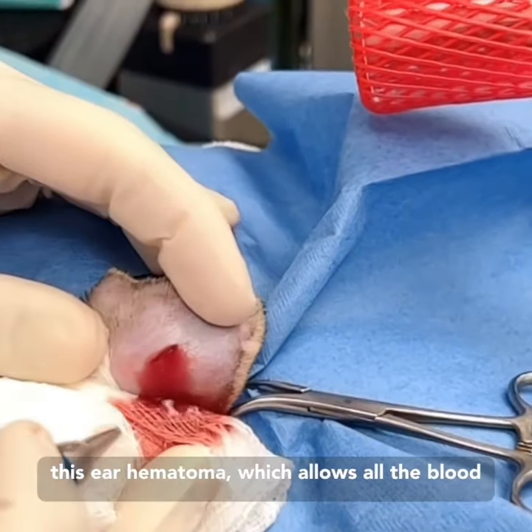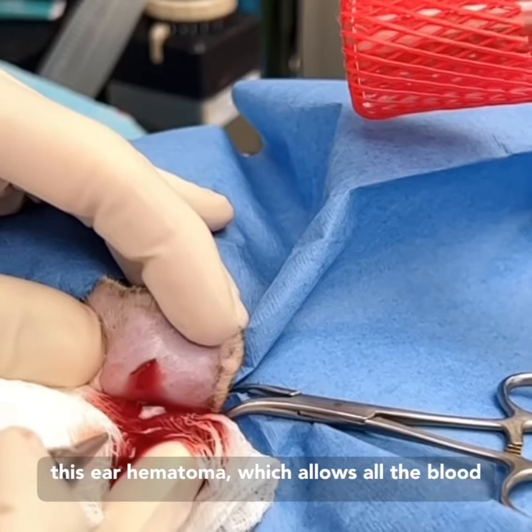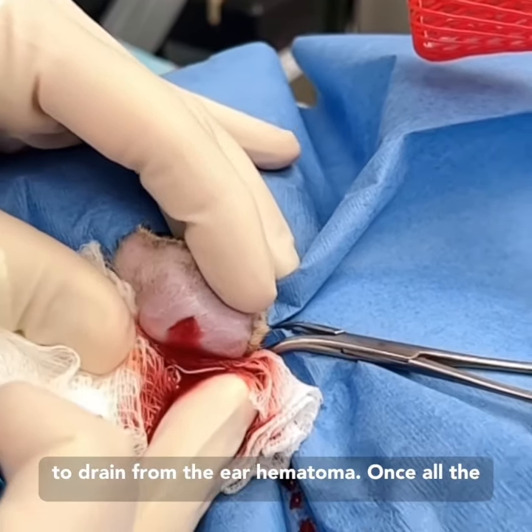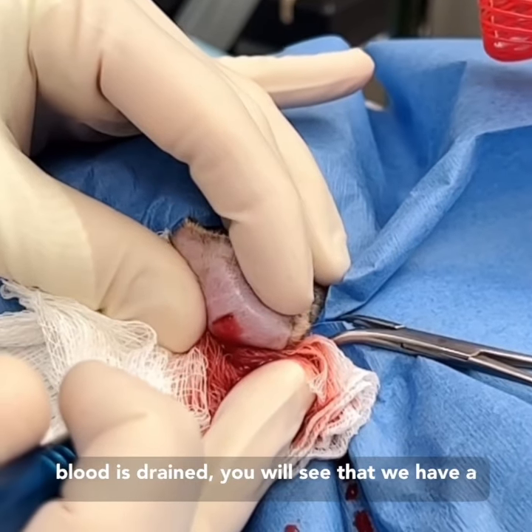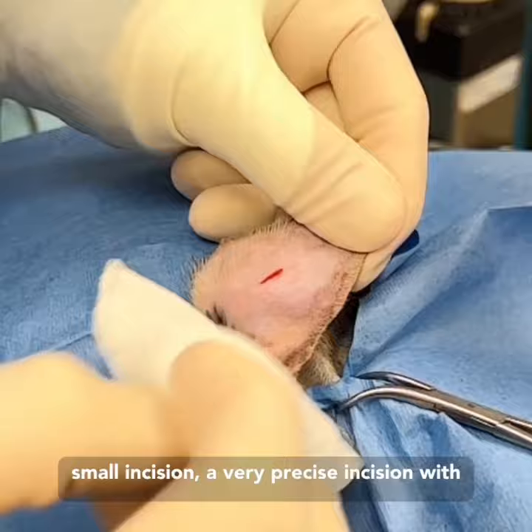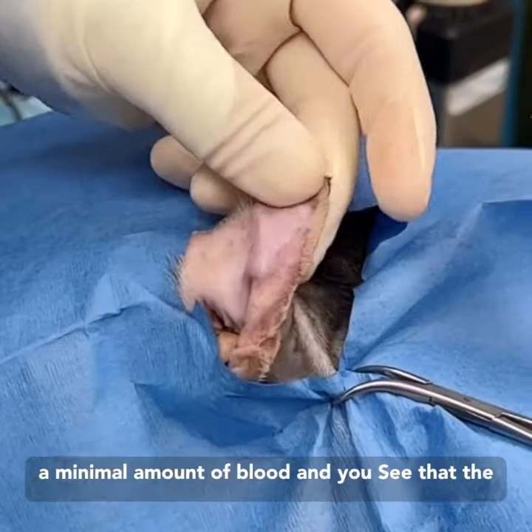Opening the hematoma allows all the blood to drain from the ear. Once all the blood is drained, you will see that we have a small, very precise incision with a minimal amount of blood.